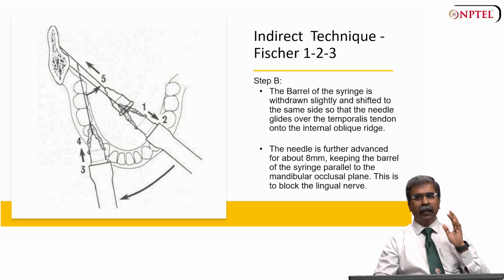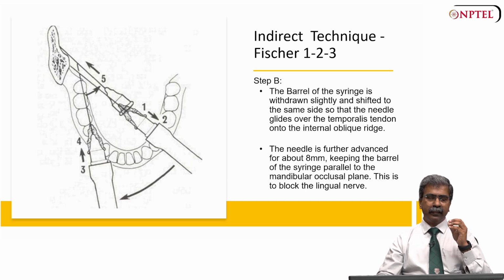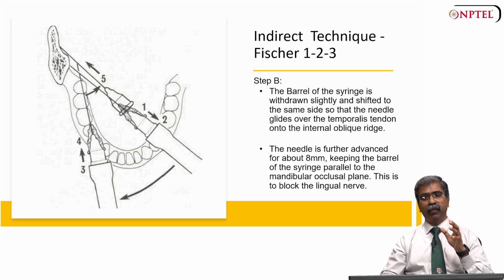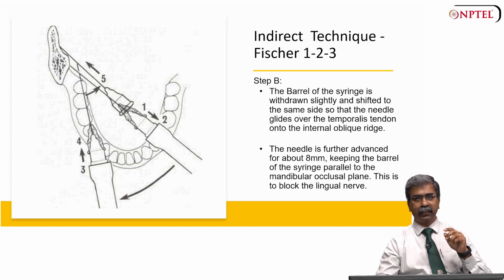By maintaining this orientation and depth, this technique successfully blocks the lingual nerve, providing anesthesia to the lingual mucosa and ensuring patient comfort during the procedures.